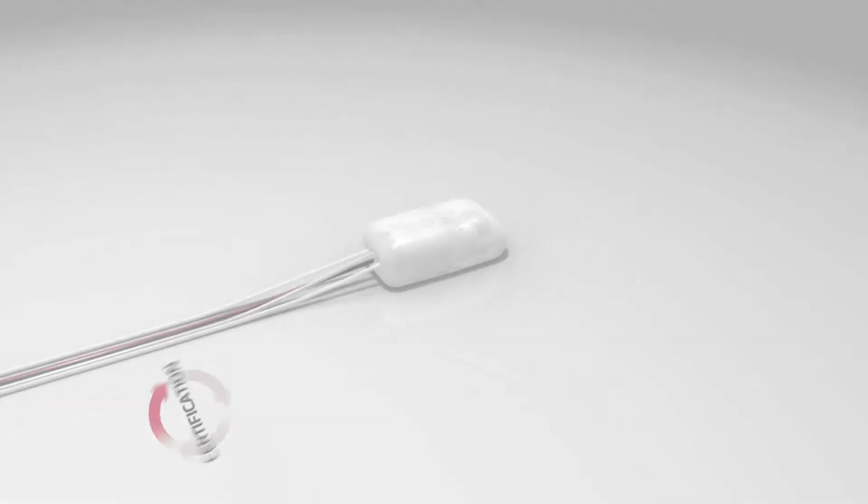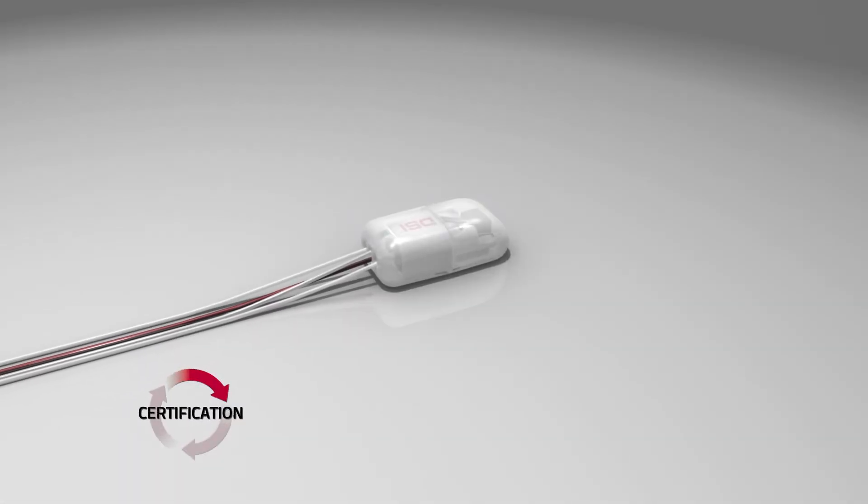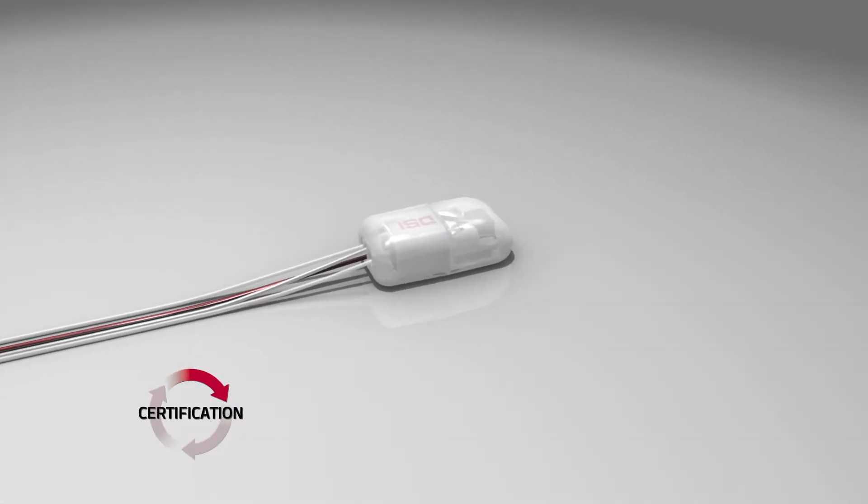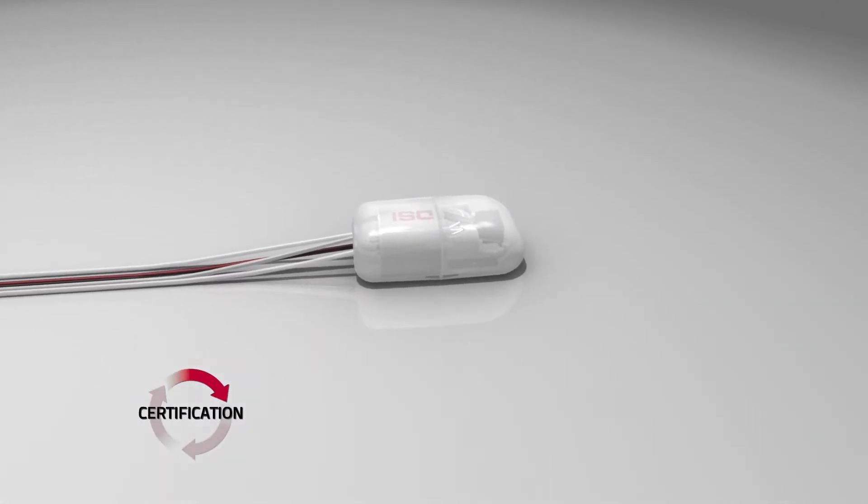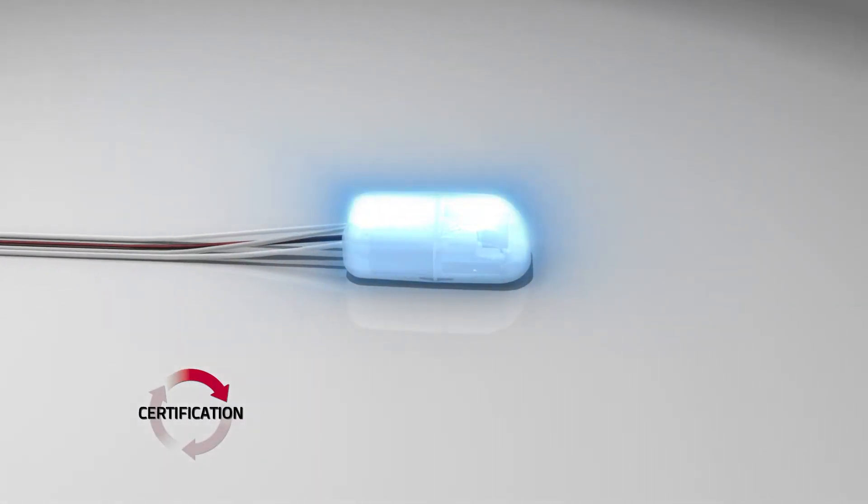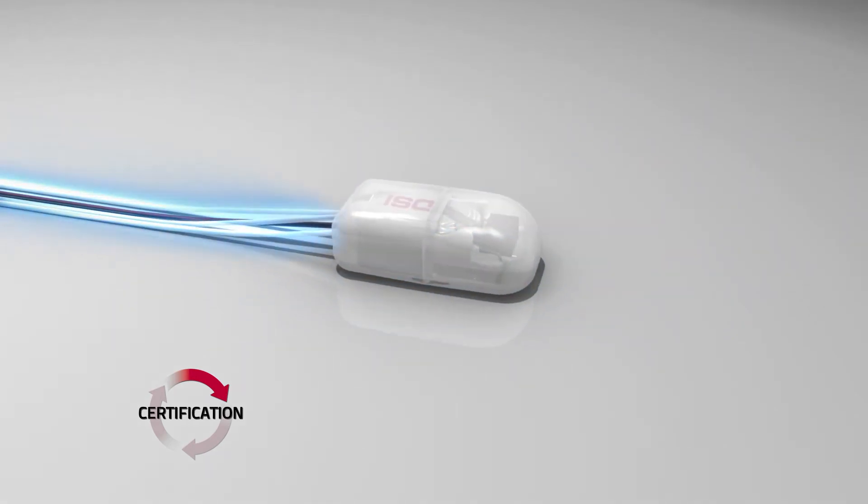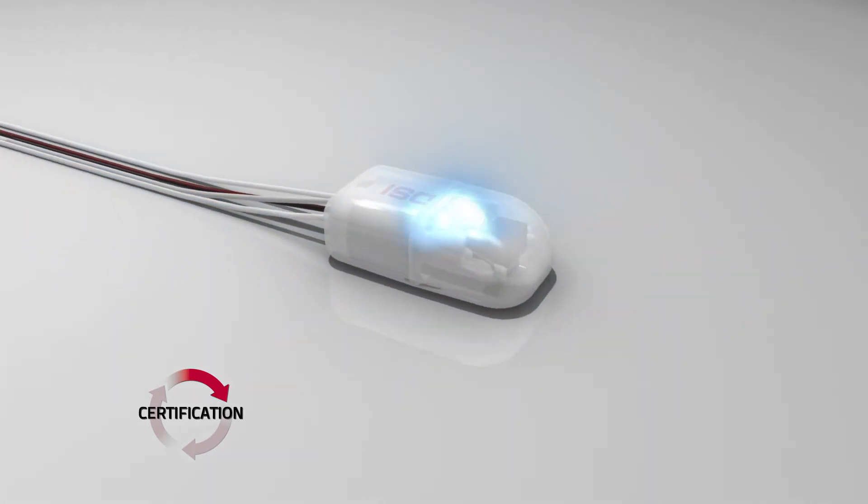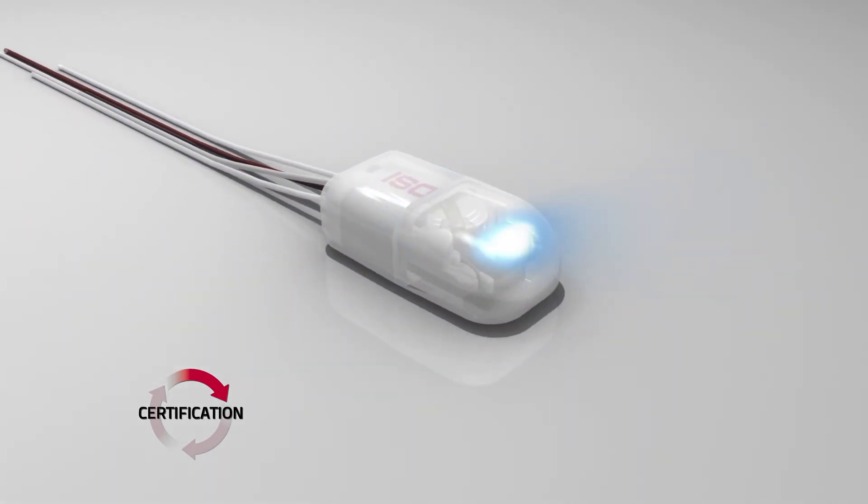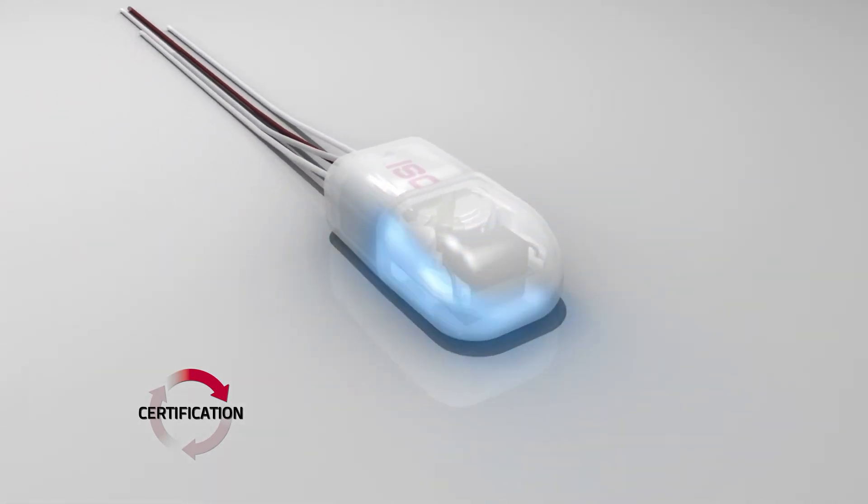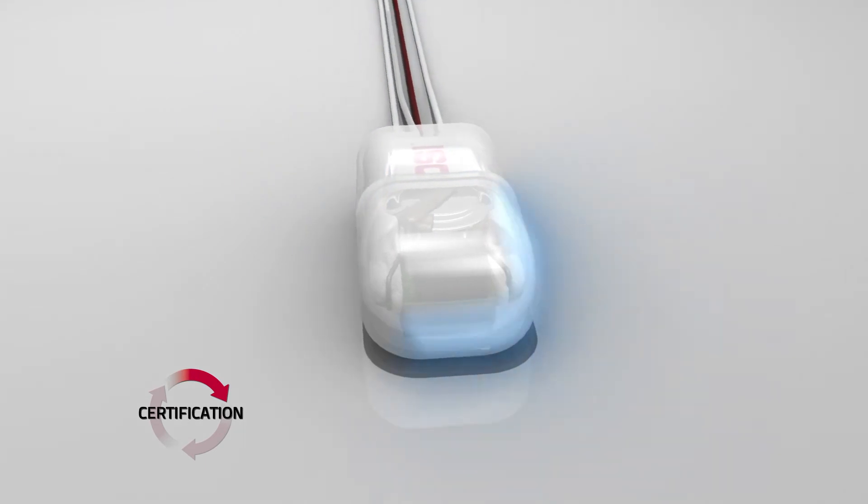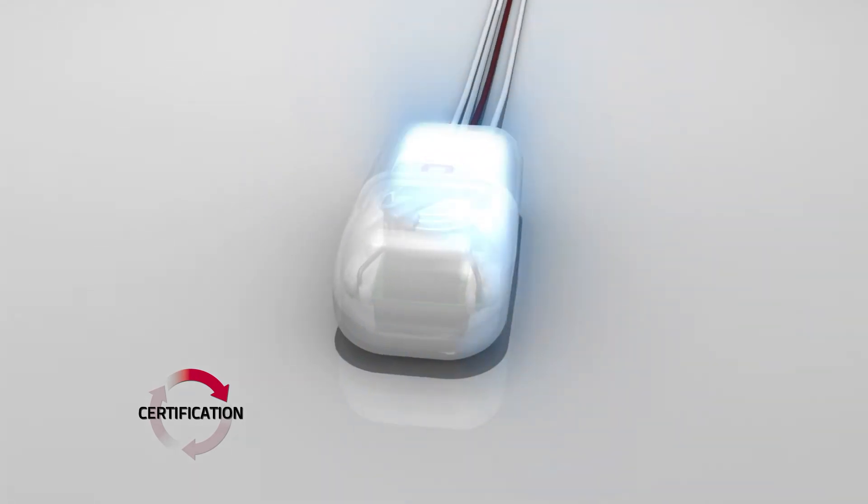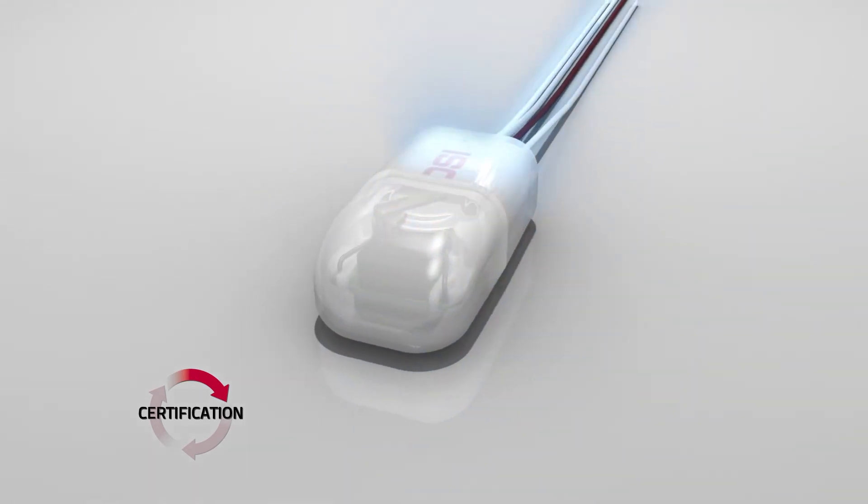To confirm that every implant we manufacture is certified to ship, we perform visual inspection numerous times throughout the assembly process. We make sure that all components are assembled correctly, are clean and free from imperfections.